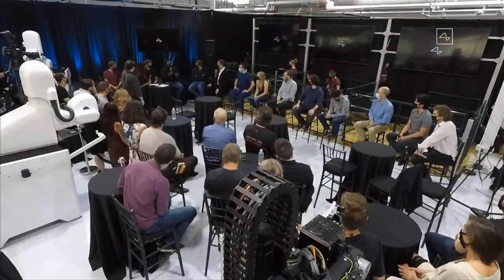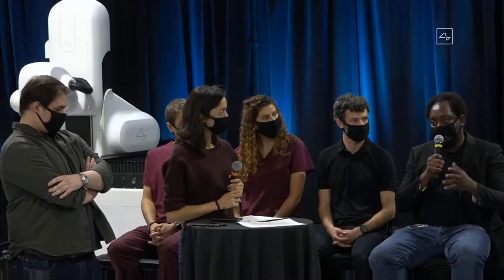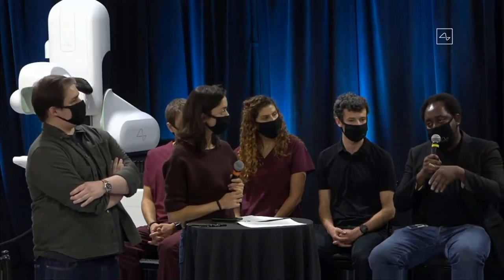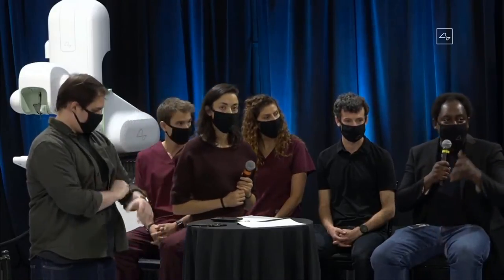So I just want to add to what you just said. The threads are actually also in the brain, and because of their thinness, they're very flexible. So as the pig is moving around and banging its head, the threads actually move with the brain, even with the normal pulsation of the brain. And that helps minimize stress within the brain tissue also, and that has a long-term impact on the functionality of the device.